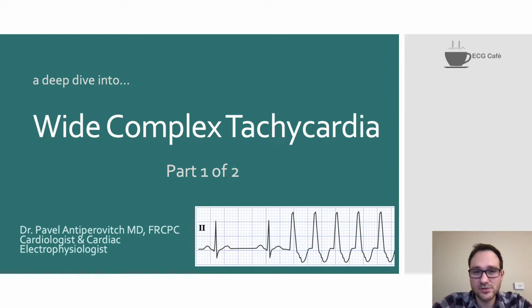I'm a Canadian cardiac electrophysiologist, and today we'll be discussing an approach to wide complex tachycardia diagnosis. Now, the approach that I will introduce you to is used by cardiac arrhythmia specialists, and it focuses on understanding the arrhythmia mechanisms. So this is the approach that's taught to cardiovascular trainees when they rotate through their EP rotation.